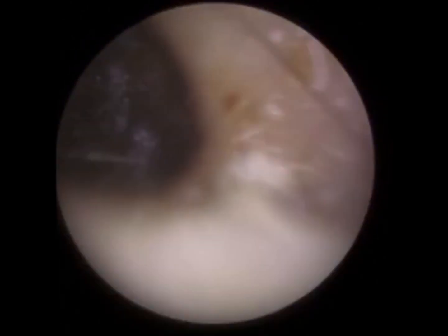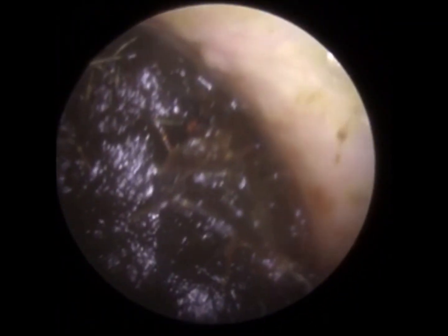So a bottle, we can put a lot of pressure in. That's not going to hurt the bottle. It might crack it, but not going to cause any bleeding or bruising or potential lawsuit against you from the bottle. But when we're doing that in a patient's ear, we're going to be really careful.